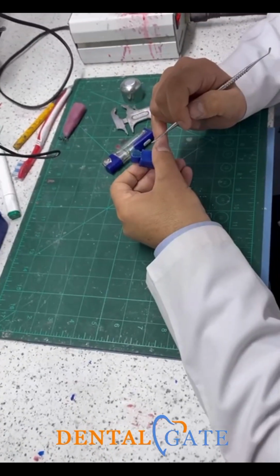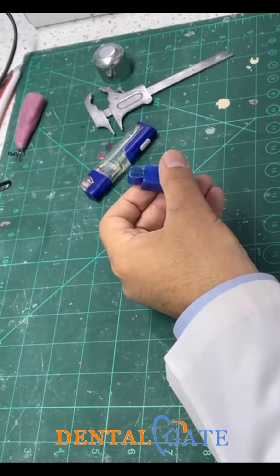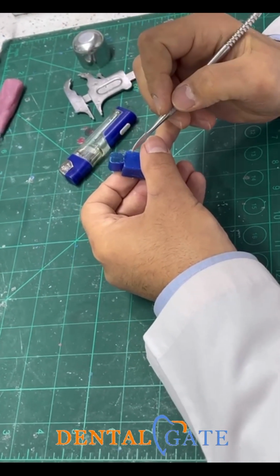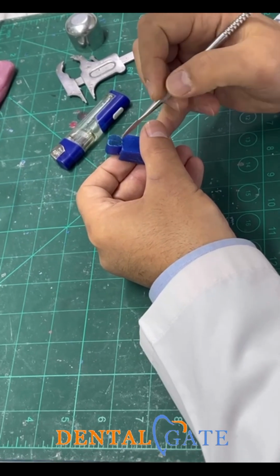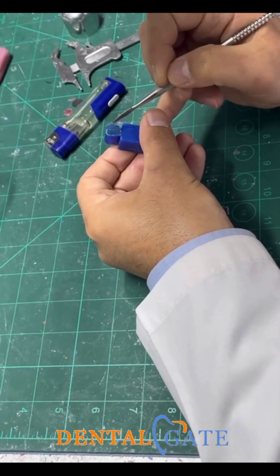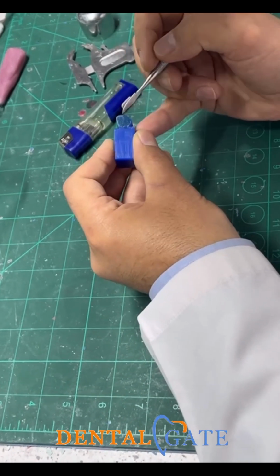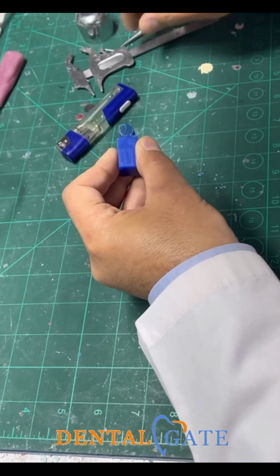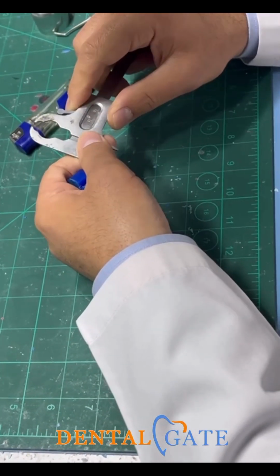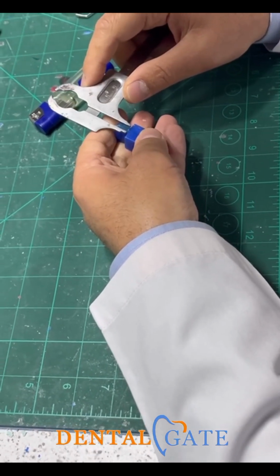We have the labial aspect of the lateral incisor, which we will depend upon for measurement. We have two measurements at the cervical line, and two measurements in the body of the crown. You can see the measurement at the cervical line was 5 millimeters only. You can double check this measurement. This is 5 millimeters.